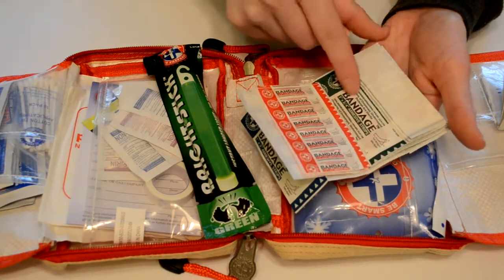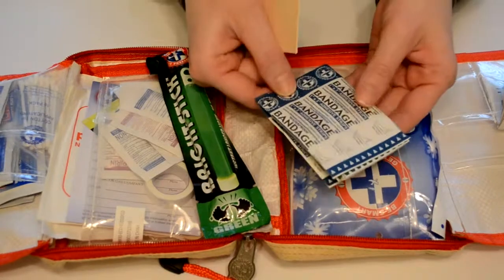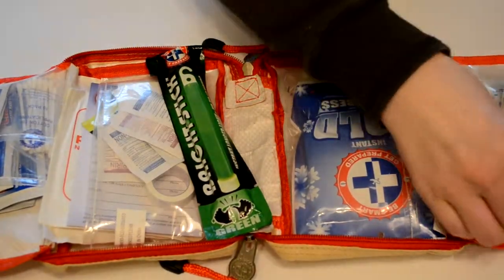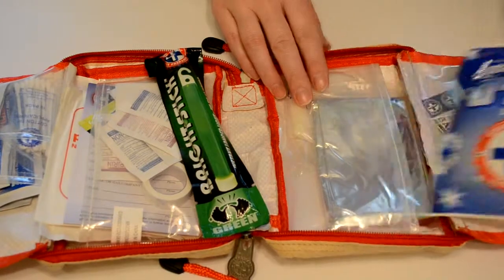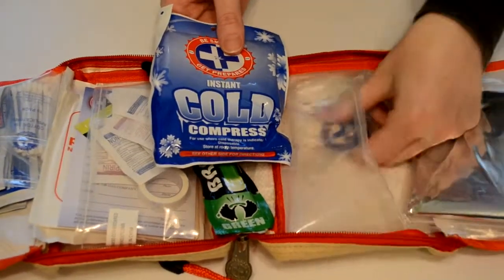We've got the small bandages — just a bunch of different size bandages in case you get cut while you're in the woods. Next we've got a cold compress here, we've got a safety blanket, and we've got some gloves.